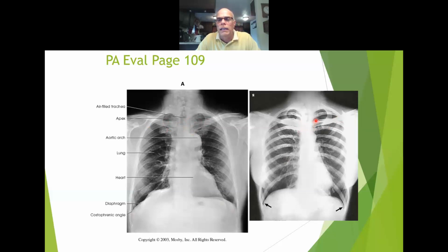This one here looks pretty good. I see a joint space, and I see a joint space. So I know that the sternal end of the clavicle has not been rotated over on the spine. The trachea visible in the midline. A little light on this one here. I would say it's right there. But here you can definitely see the gray, the darkness of the air right there.